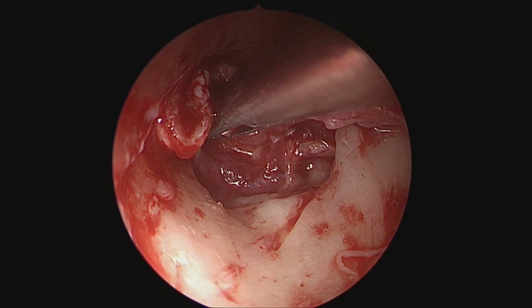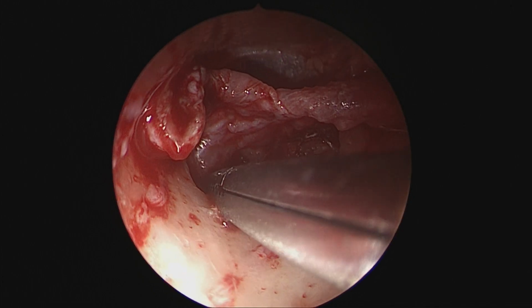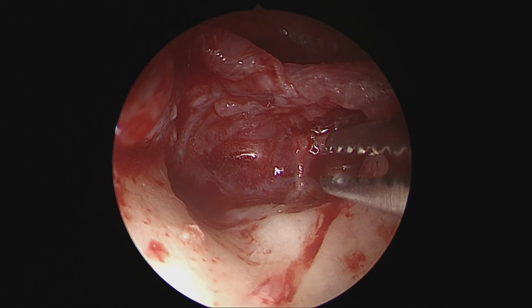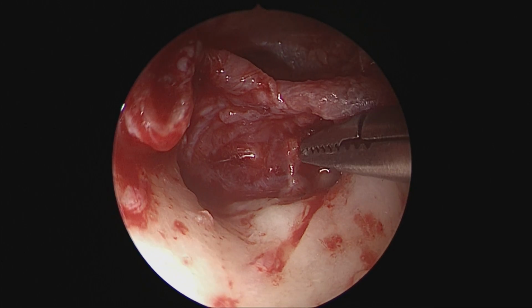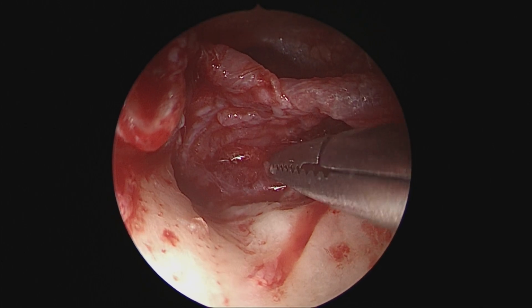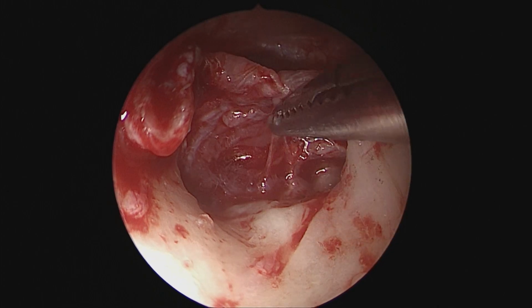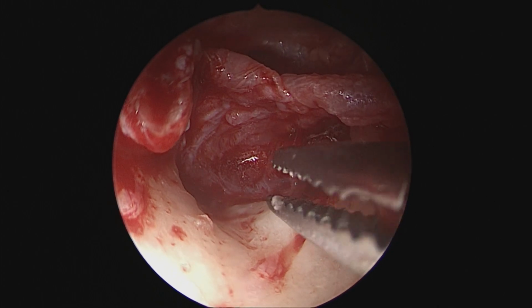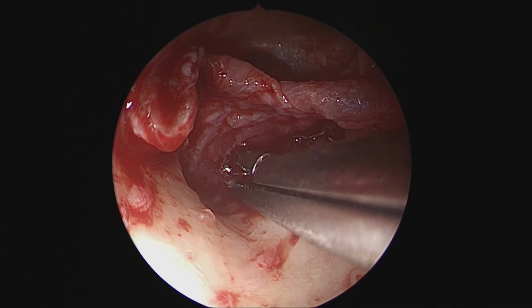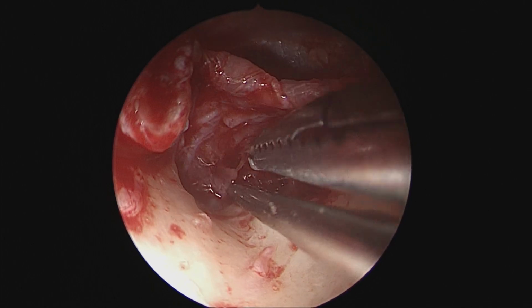So what we do is first we remove some or most of the posterior mesotympanic soft tissue, that is the polypoidal mucosa, for disease clearance as well as for biopsy specimens. This has to be sent just to exclude any granulomatous disease such as tuberculosis. And as a practice, we also send some tissue for culture.